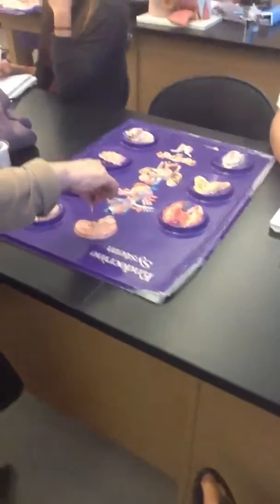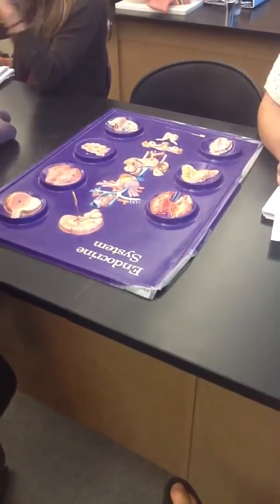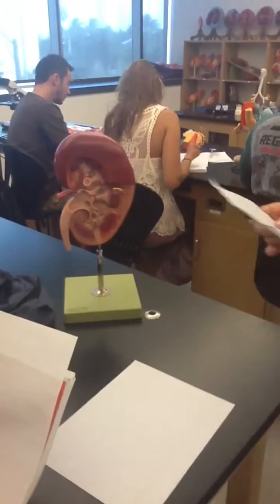20. What is this gland here that is pointing to? Pituitary gland, hypophysis. That's the gland. 21 is the thyroid gland in the thyroid slide. We already saw that one. 22. What is this? It's a renal pyramid.